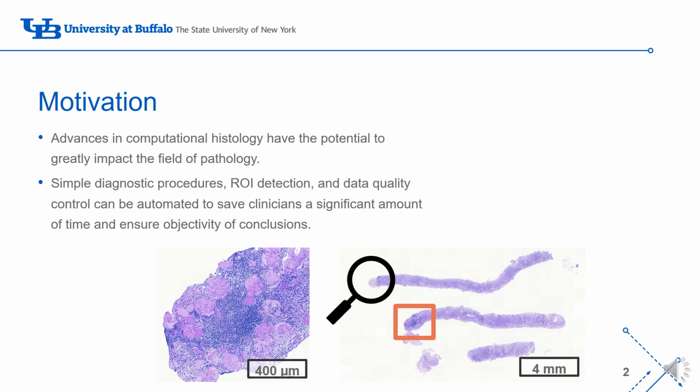This is especially important in the analysis of whole slide images, or WSIs, due to their extreme size compared to more general image classification and segmentation datasets. The almost gigapixel dimensions of some WSIs makes the exhaustive search for etiologic features highly time-consuming.